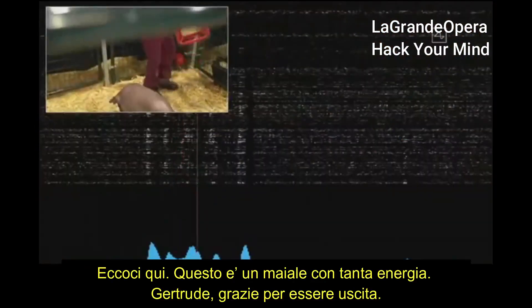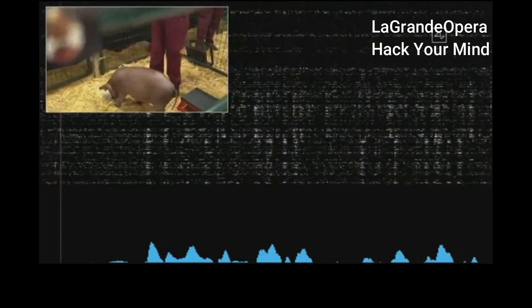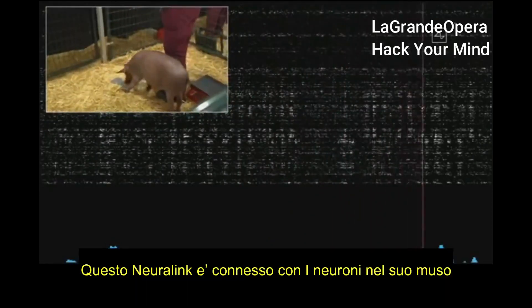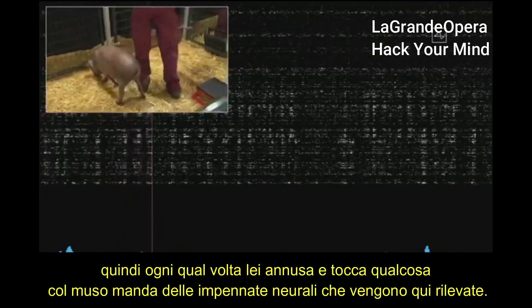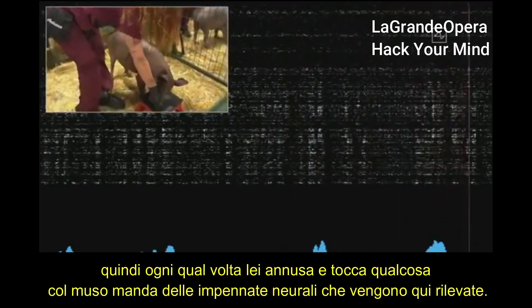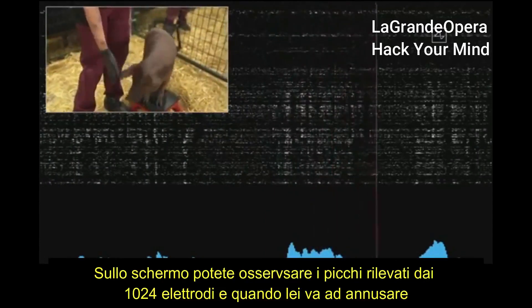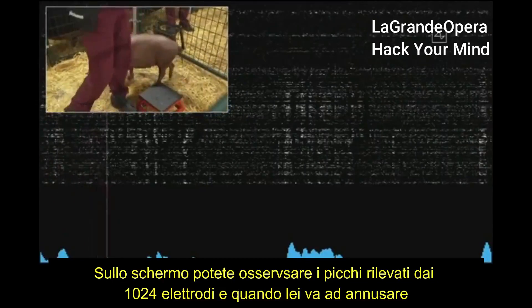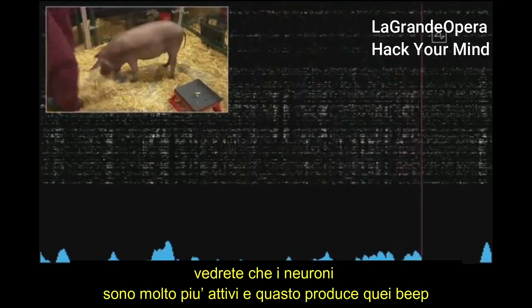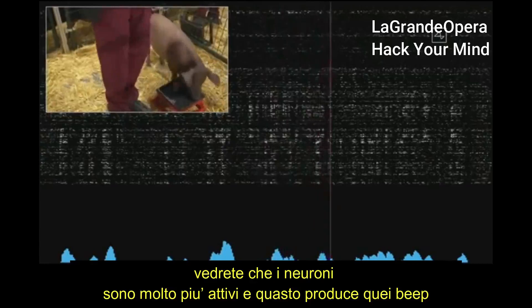Gautry, thanks for coming out. The beeps you're hearing are real-time signals from the neural link in Gautry's head. This neural link connects to neurons in her snout. Whenever she snuffles around and touches something with her snout, that sends out neural spikes detected here. On the screen, you can see each of the spikes from the 1,024 electrodes. If she snuffles around, touches her snout to the ground, or you feed her some food — pigs love food — you can see the neurons fire much more than when you're not touching the snout. That's what's making the beeping sound.